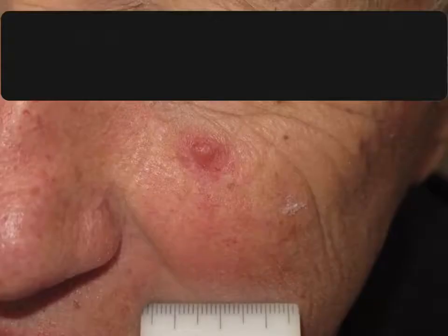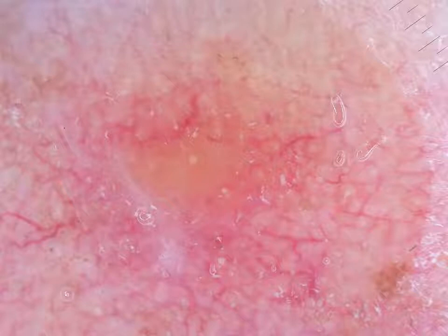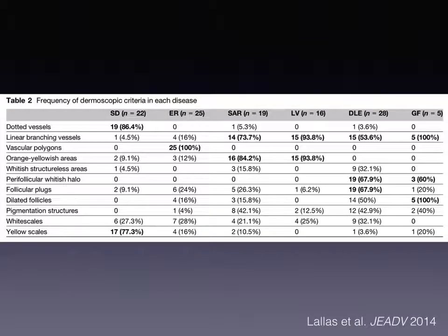This is another example of sarcoidosis manifesting as a solitary papule on the face, dermoscopically displaying yellow patches and linear vessels. As shown in this table, this dermoscopic pattern is very common in granulomatous dermatoses and very uncommon in other entities, so it is particularly useful for their recognition.